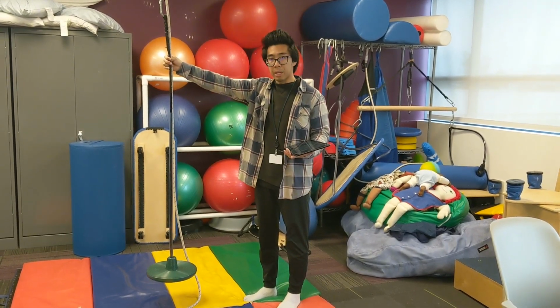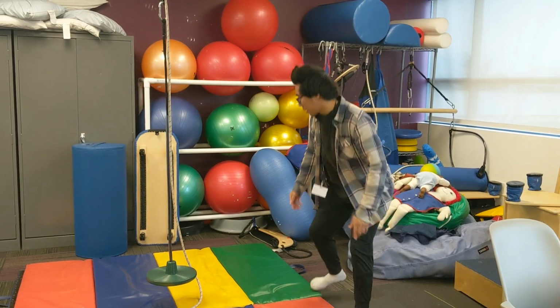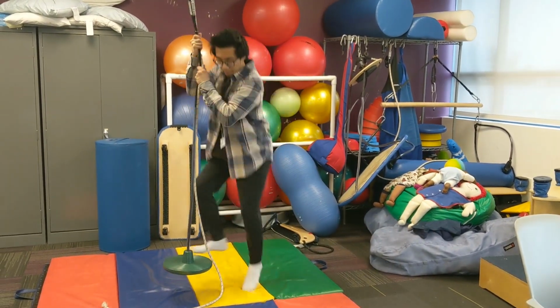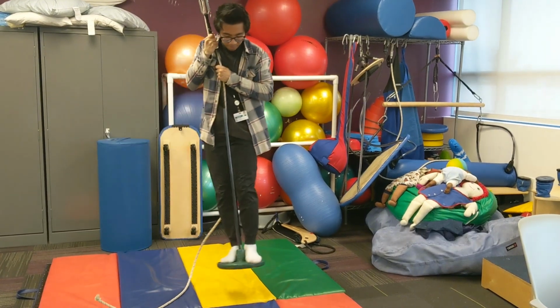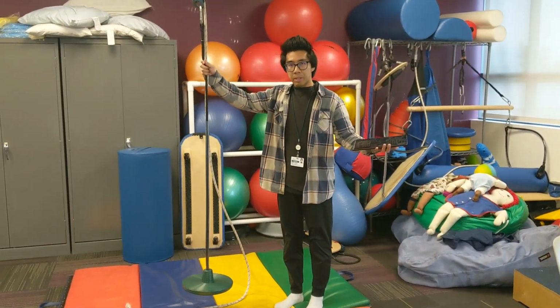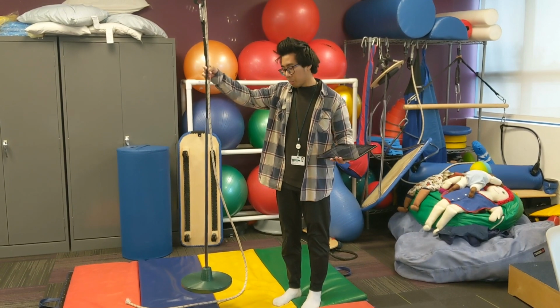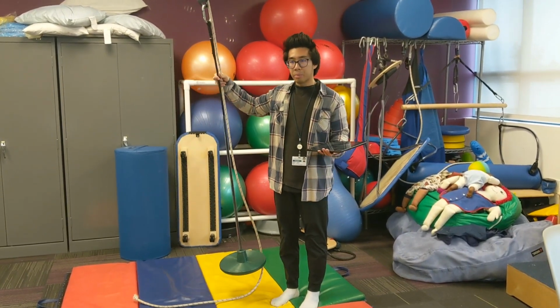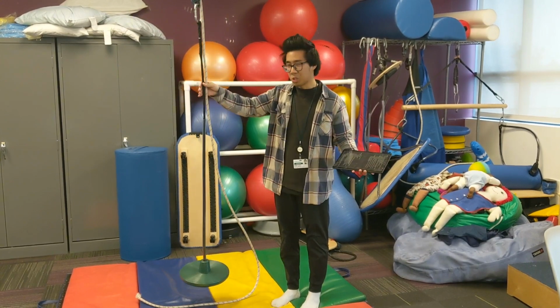As well as your dynamic standing balance. The way this works, the child will jump onto it with two feet, just like so. For example, in treatment for children, if a child wants to role play, they could swing from one pirate ship to the other, or they could pretend they're Tarzan swinging through the jungle.